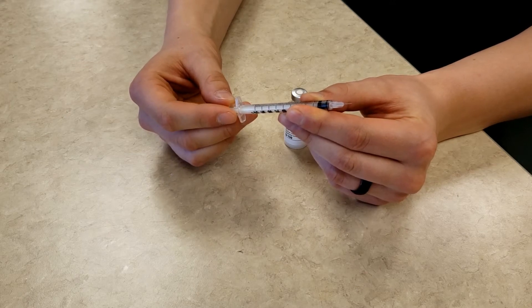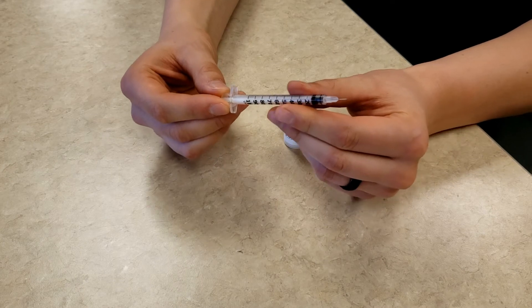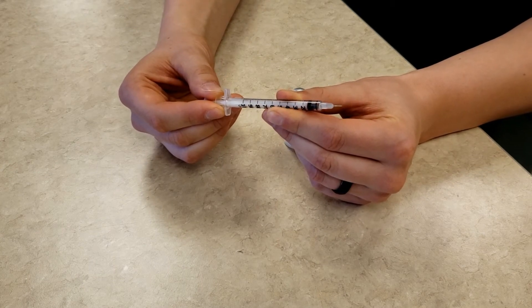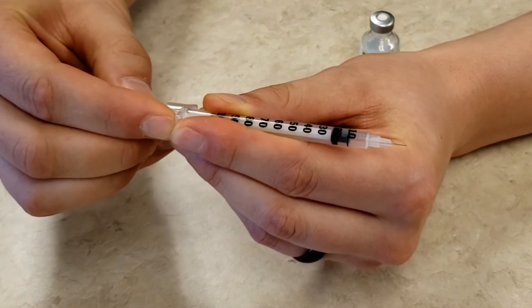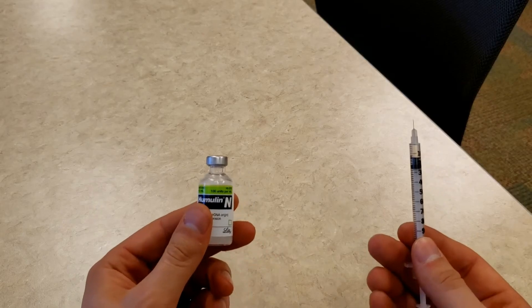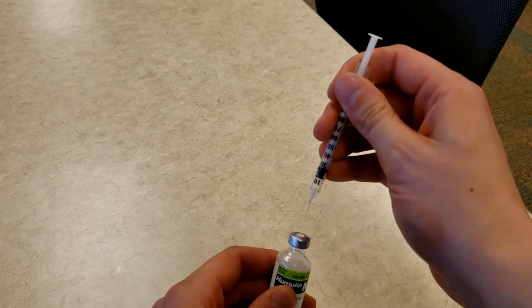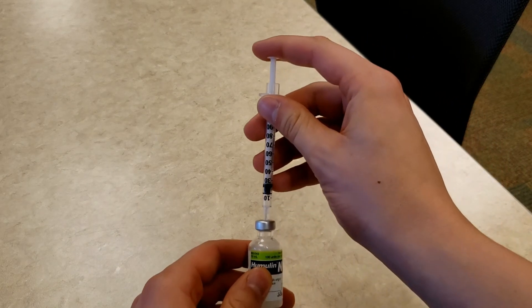To do this, you need to pull the plunger on the syringe to your desired dose — in this case I am going to pull my plunger to 14 units. Then poke the syringe into the top of the insulin bottle and push the plunger all the way down so that the air goes into the bottle.